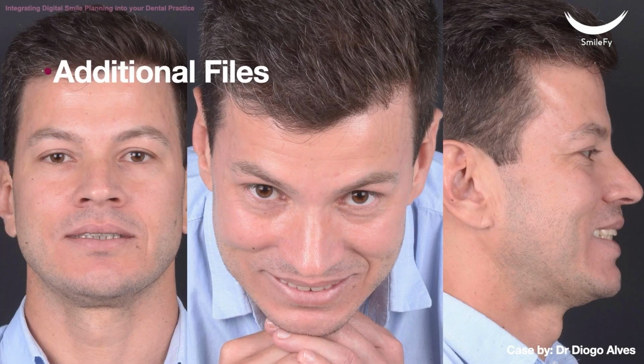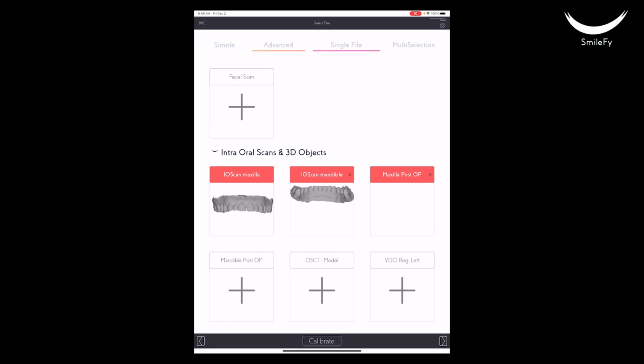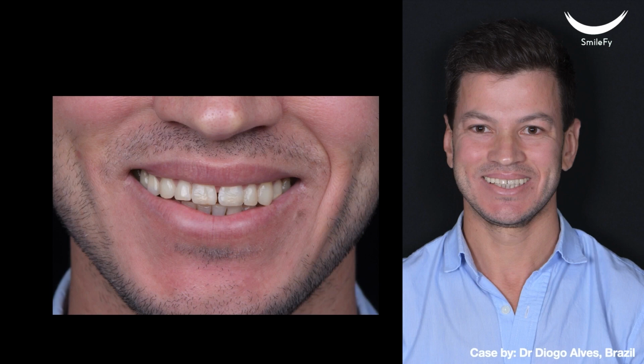With proper clinical exams and proper picture protocol and intraoral scan, you can then add these files into the SmileFy software to begin your 3D dental wax-up. So as you can see here, the patient has a canted smile and old composite restorations.